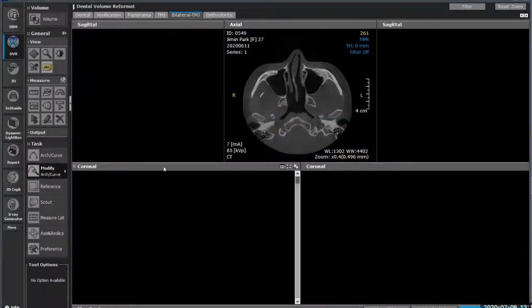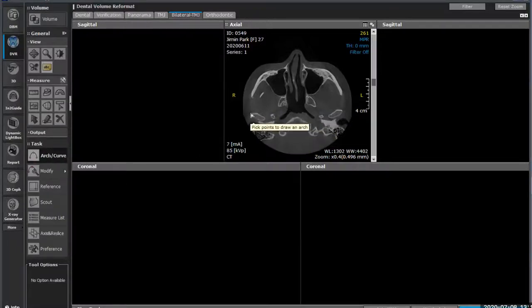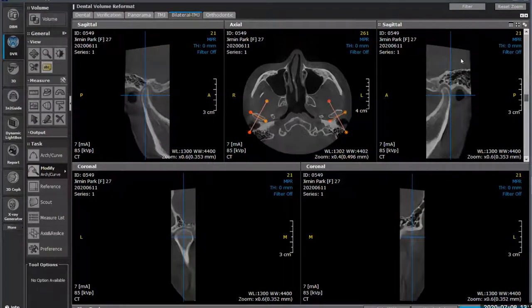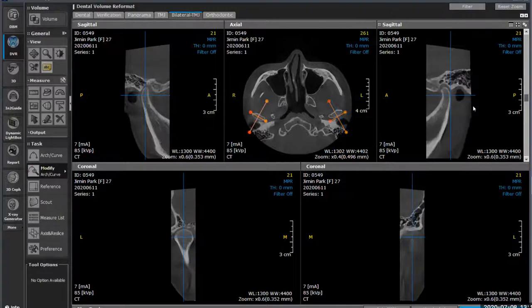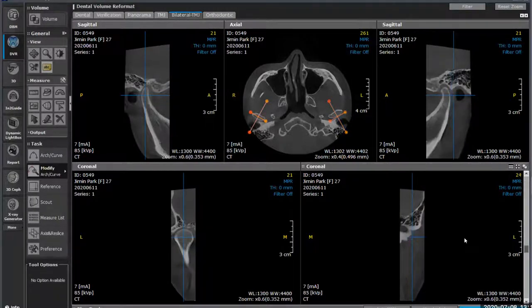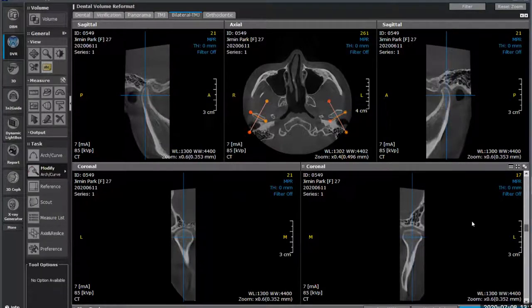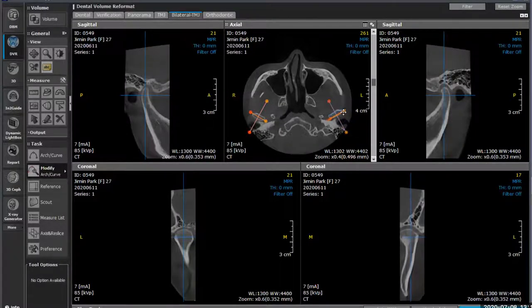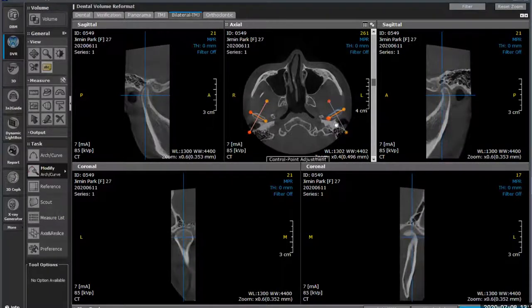Now we've split it apart and can actually start to see bilaterally how we can compare the two in similar positions. Moving the blue line as it crosses gives you an idea of where you are. I can move that blue line closer to where the other condyle is so now we can get truly comparative views of what's going on inside there. I can make those views larger by moving not just the line but the point itself.